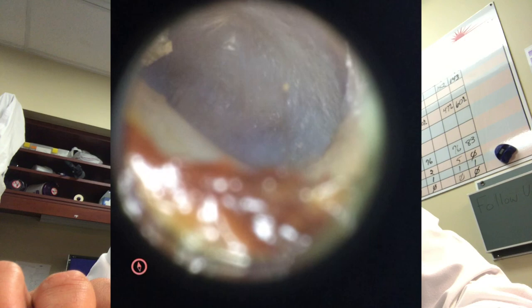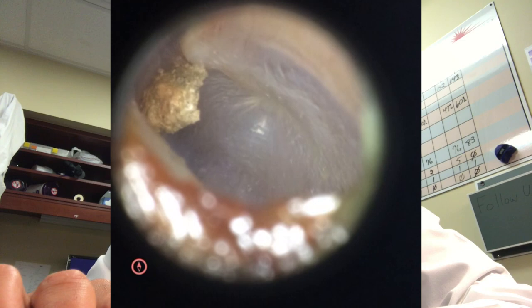I can show the patient their ear infection or whatever they've got. We're going to go through a couple of ear exams. First, we'll start with a normal ear exam. You'll see the autoscope going into the outer ear canal — the tympanic membrane looks nice and pearly and white. There's a little bit of cerumen, which is supposed to be there to protect the external ear from bacteria, organisms, and little insects.